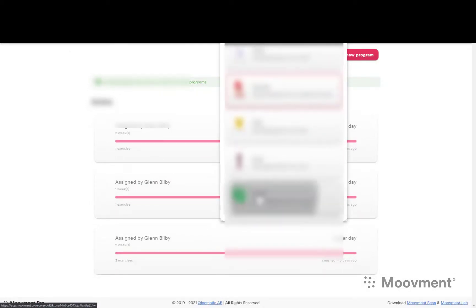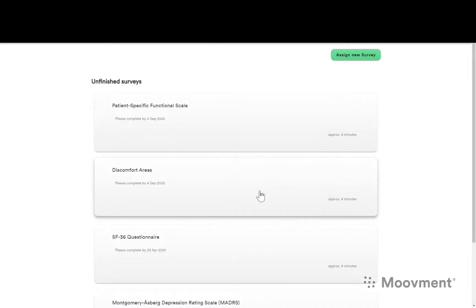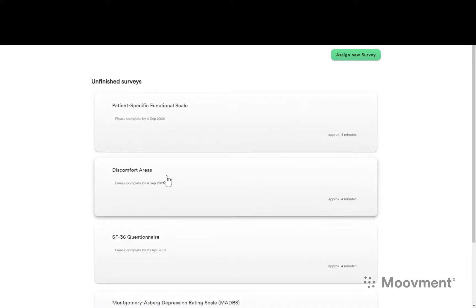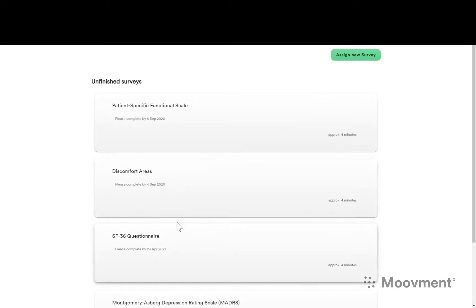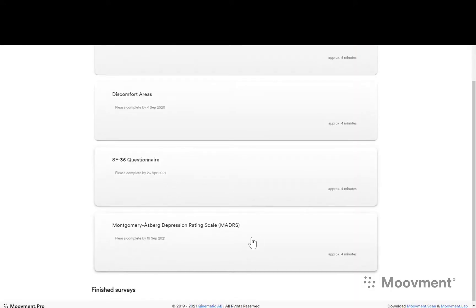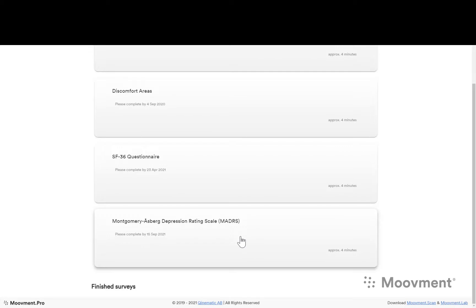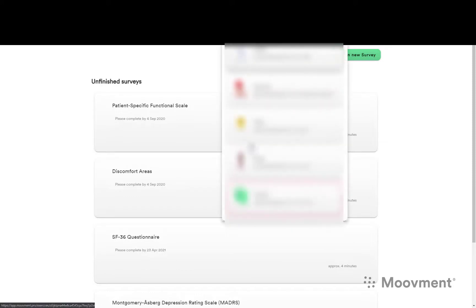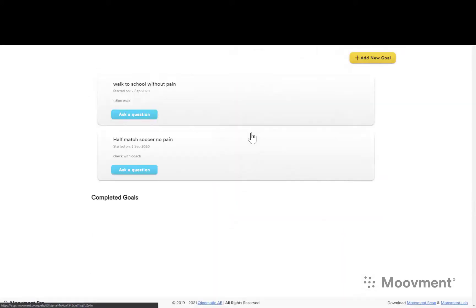You can send surveys, patient specific functional scale, you can send pain charts, lifestyle questionnaires, depression scale just in case you suspect that they won't do their rehab because they're not motivated. And you can set goals which is very important so that they have something that matters to them to reach.